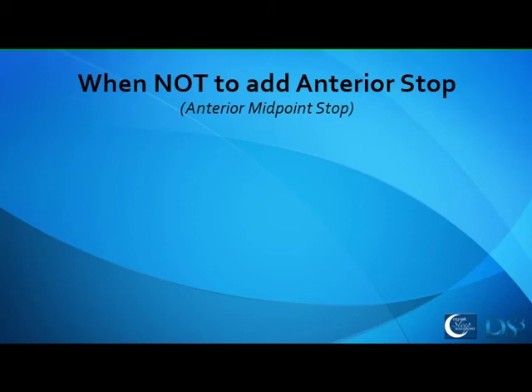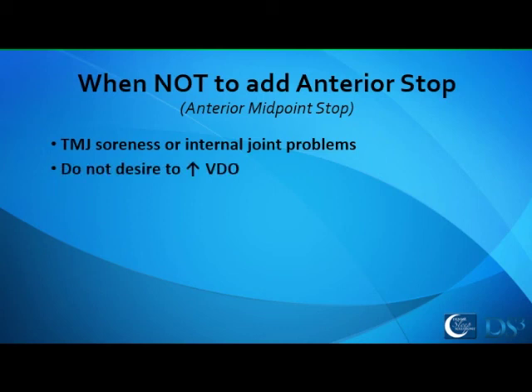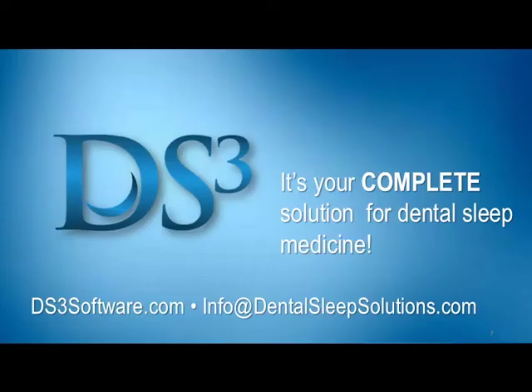When we don't want to add the anterior stop, the number one contraindication is if we're concerned about the joint itself. If they have internal joint problems or crepitus or anything else that we may be concerned about, where this device may put more force on the joint, and that may not be wanted, we've got to be cautious of that. And if we don't want to increase the vertical dimension of occlusion, then we certainly don't want to consider adding an anterior stop, because by design we're going to do that somewhat.